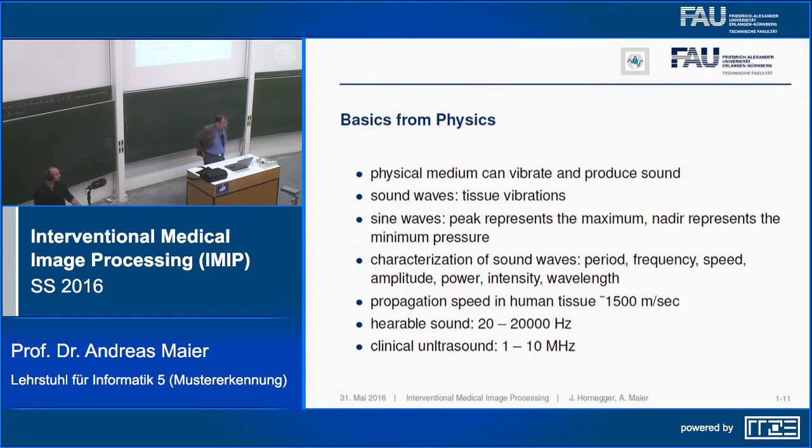Very well. In clinical ultrasound, we have 1 to 10 megahertz, so it's a much higher frequency, so we won't actually be hearing anything if somebody is undergoing an ultrasound diagnosis. You can't perceive this with your ear.